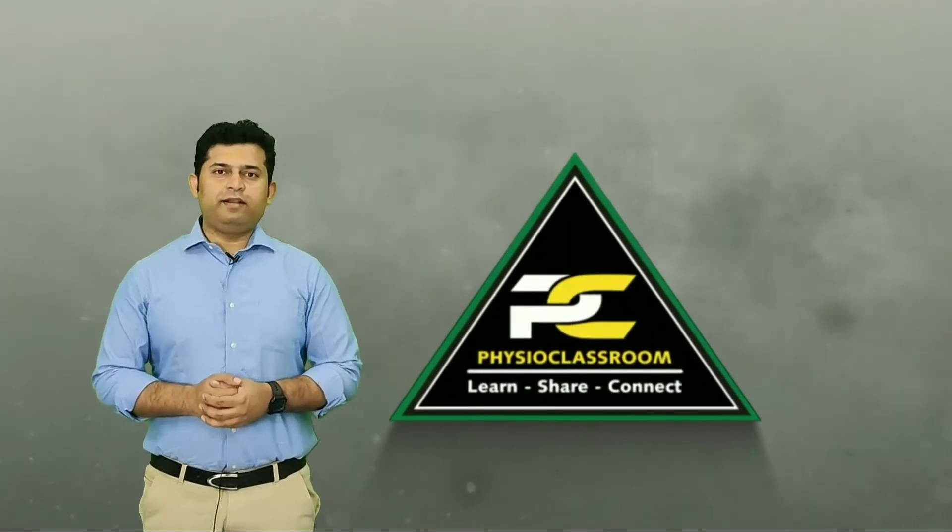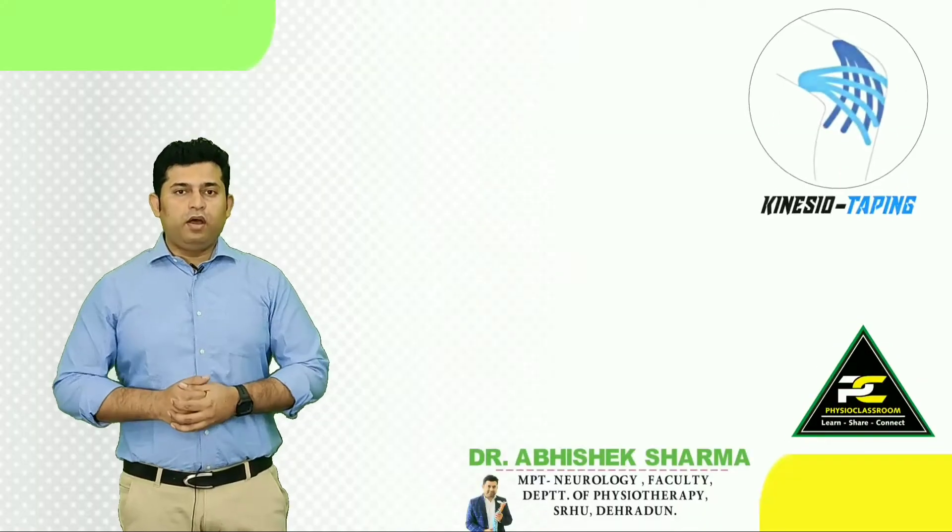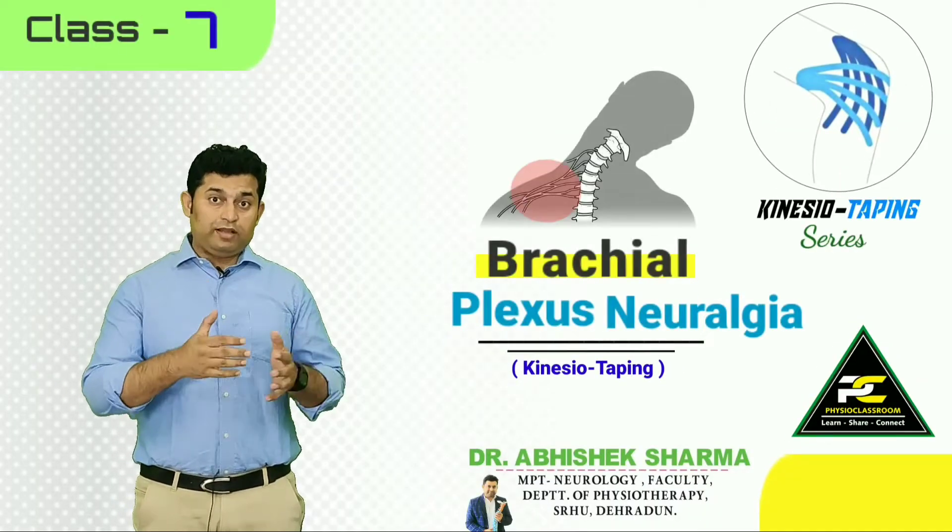Hello everyone, you are watching the Physioclassroom channel, and in this video we are going to learn the kinesio taping application for brachial plexus neuralgia.